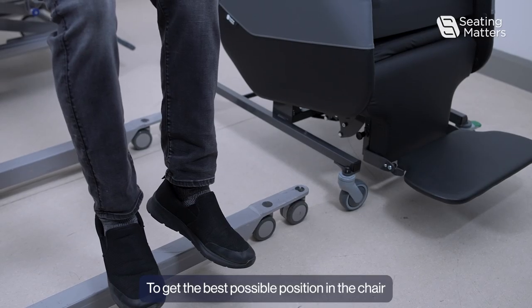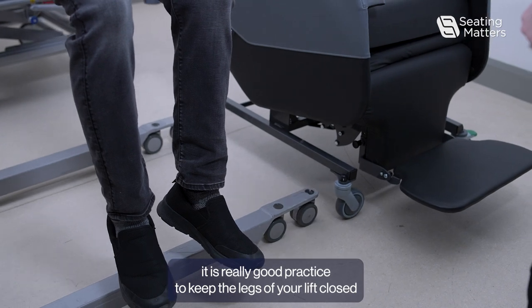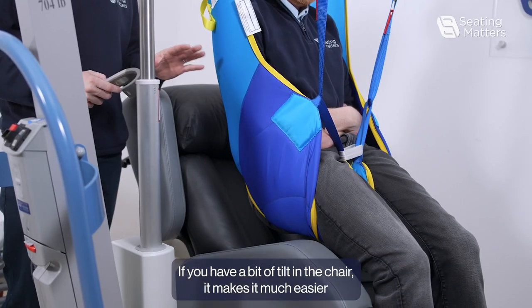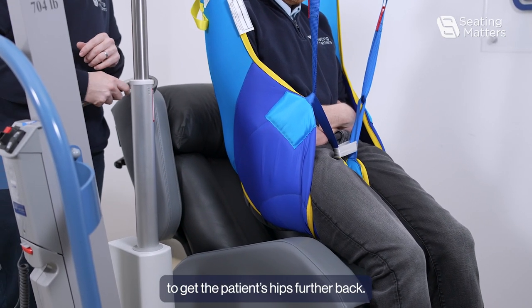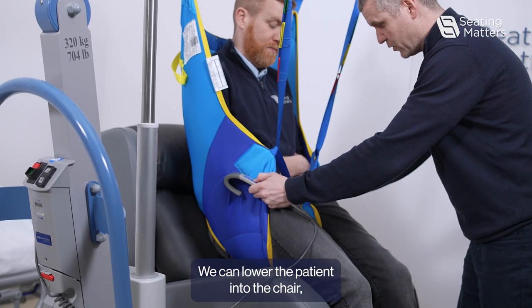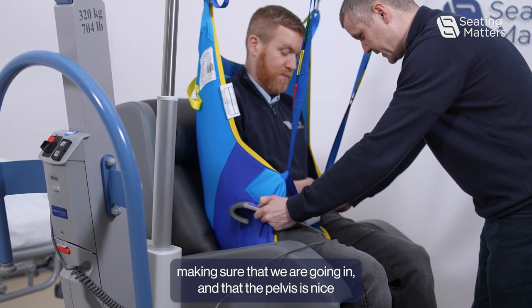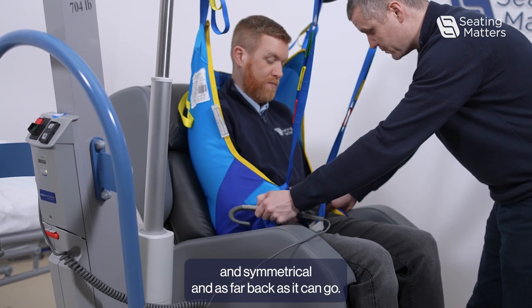To get the best possible position in the chair, it is really good practice to keep the legs of your lift closed as far as they can and push them in between the two wheels of the chair from the side. If you have a bit of tilt in the chair, it makes it much easier to get the patient's hips further back. Then gently pushing the patient's hips back, we can lower the patient into the chair, making sure that the pelvis is nice and symmetrical, and as far back as it can go.